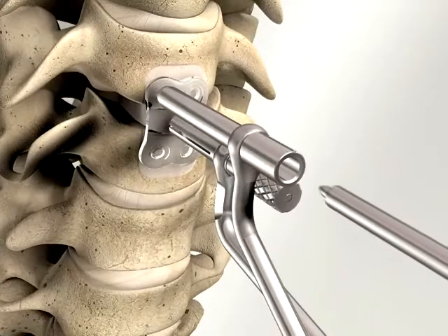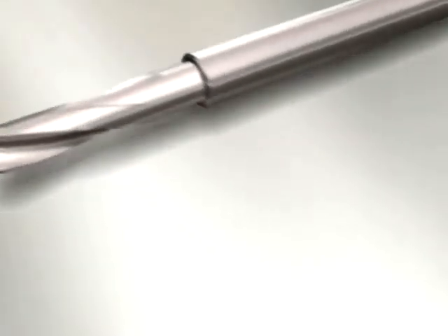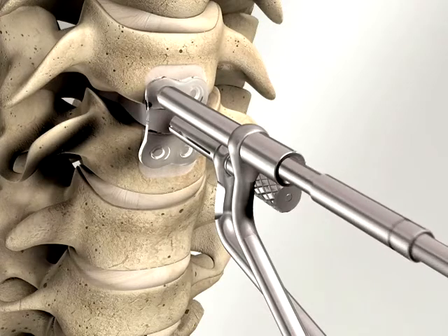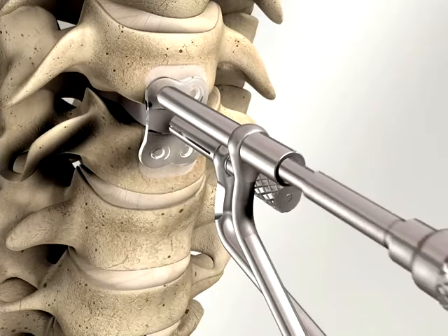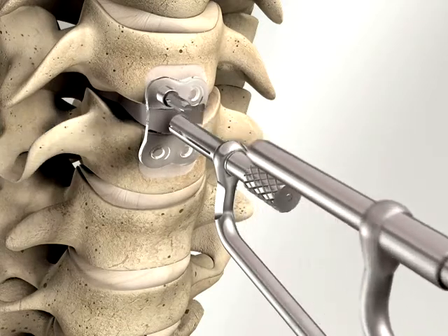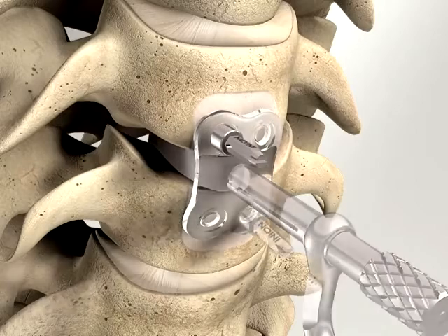Always position the punch instrument through the drill guide. Use the special drill to create a hole for the self-tapping temporary fixation screw. The temporary fixation screw is then engaged to immobilise the plate for the secure placement of the system screws. It is recommended that two temporary fixation screws are inserted to avoid plate movement.